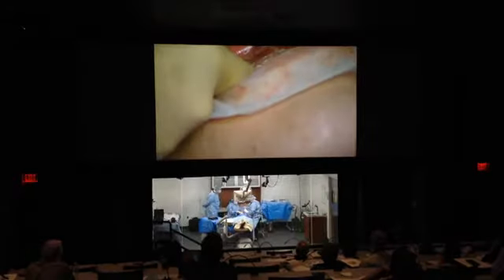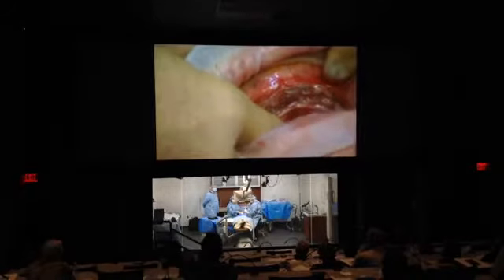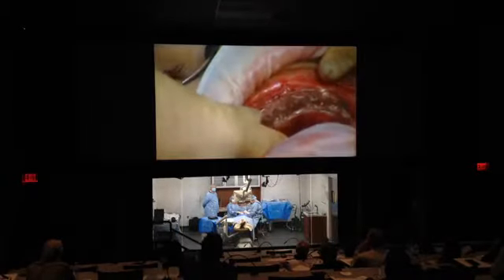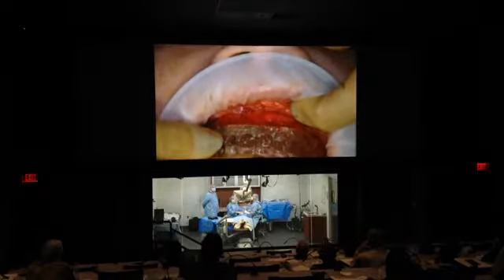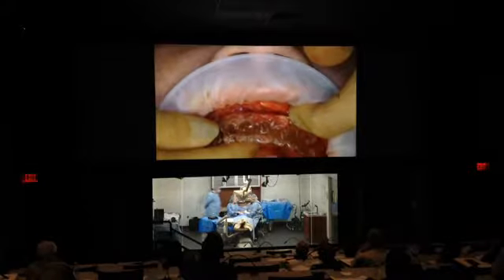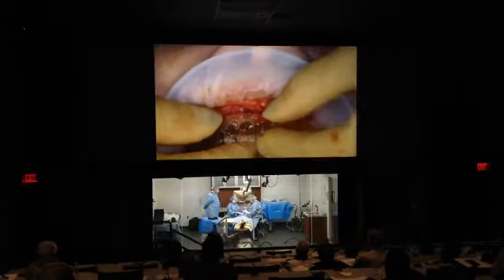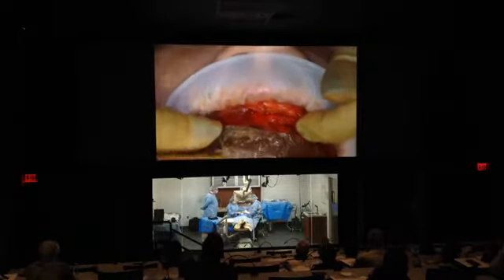Now, Maria, tilt your chin down a little bit. Tilt your chin in. Perfect. Is that better? Yeah, see, so basically, maybe just a millimeter or two over. So I need to reduce the bone with a rongeur, typically. Greg is telling me this is measured at 15 millimeters. That's the thickness, or the height of the prosthesis that we would like to have.